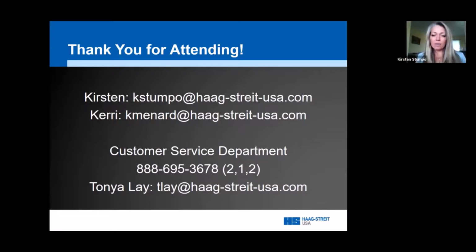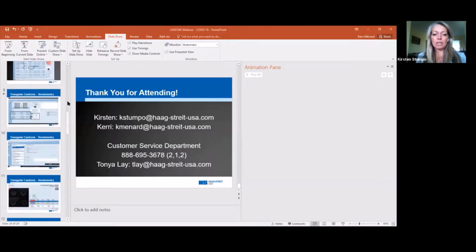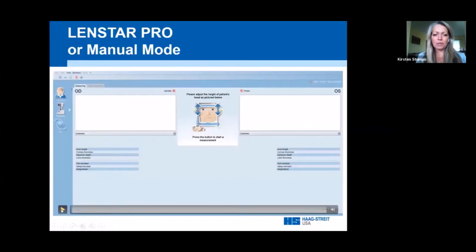Okay, yeah, so I think what is happening is when you're going in and focusing, and if you could briefly show that video too of focusing, that would be great to have running in the background there. Yeah, manual mode is probably fine. But when you're doing the initial focus alignment, you're going towards the patient until you get separated 32 keratometry data points. Then you click the button again. Right?